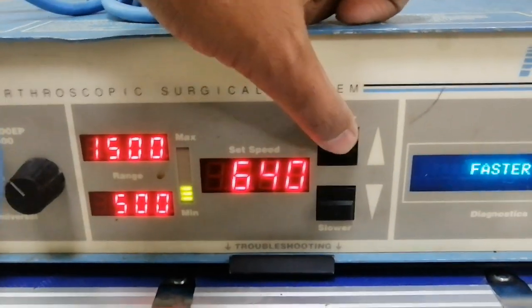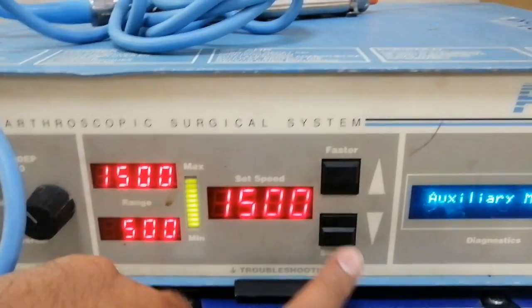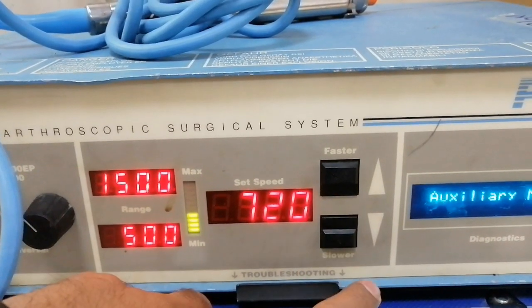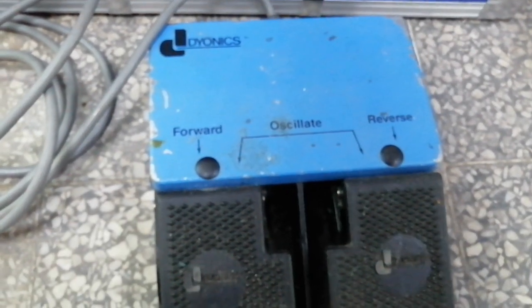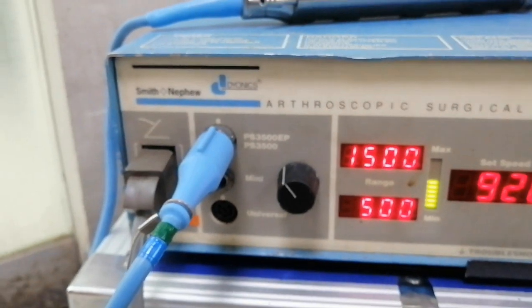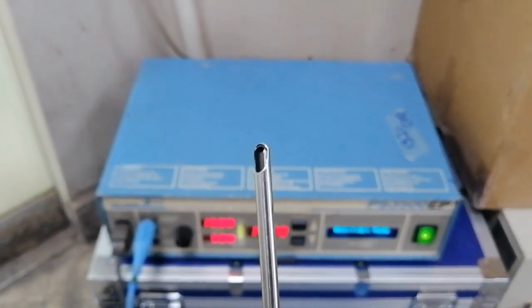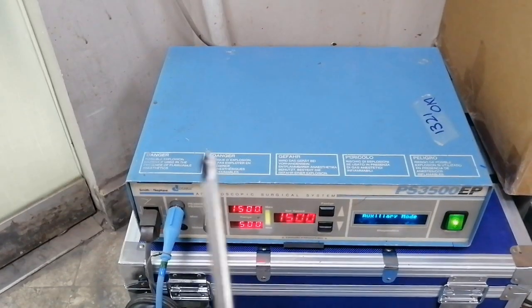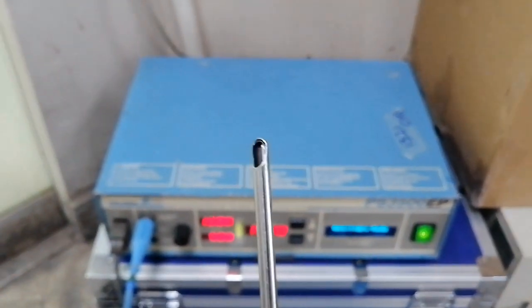We press the forward, faster, and slower buttons to increase and reduce the RPM speed of this machine. Here is the foot controller switch which controls the forward and reverse functions. When we press the forward button the handpiece rotates clockwise, and when we press the reverse button the handpiece rotates anticlockwise. Pressing the forward and reverse buttons continuously operates the machine as per our instruction.